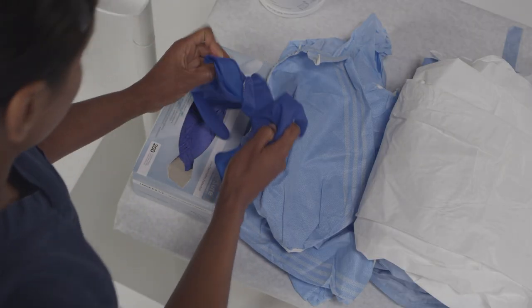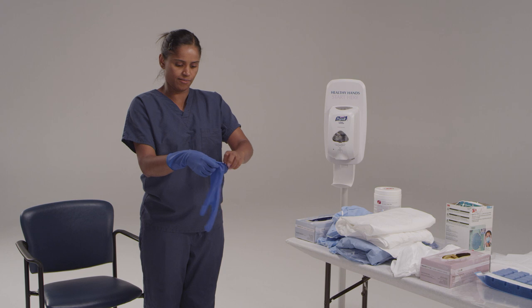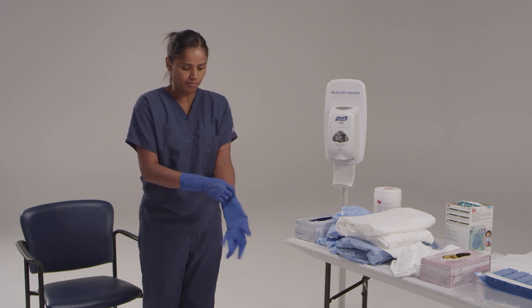Now we need to put on a pair of gloves. This is not a sterile procedure. Put on the first pair of gloves. Make sure to get the cuffs of the glove as far up as possible.